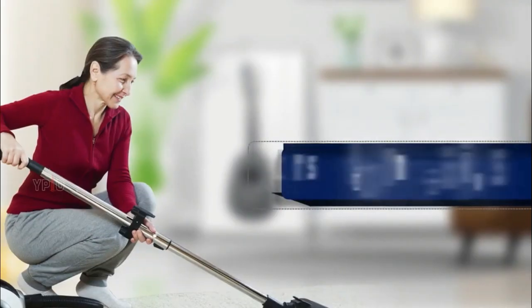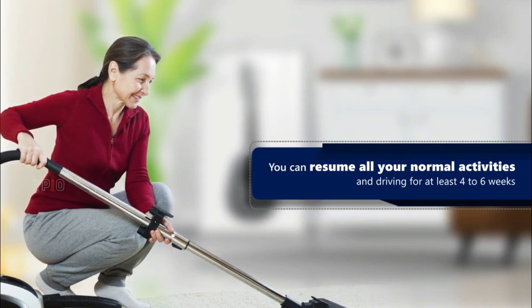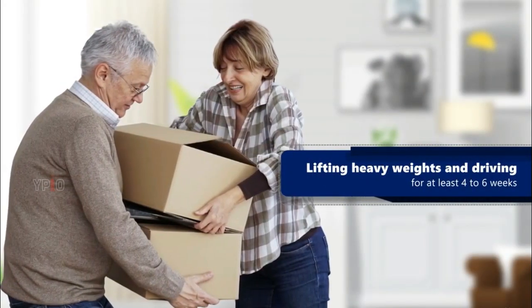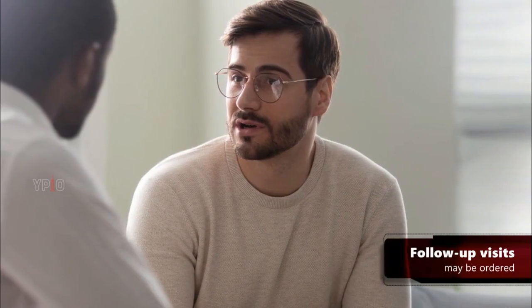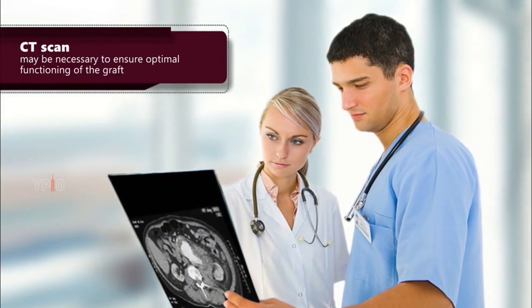You can resume all your normal activities within a month, but you should refrain from strenuous activities, lifting heavy weights, and driving for at least 4 to 6 weeks, or until your physician approves. Follow-up visits may be ordered, during which a CT scan may be necessary to ensure optimal functioning of the graft.